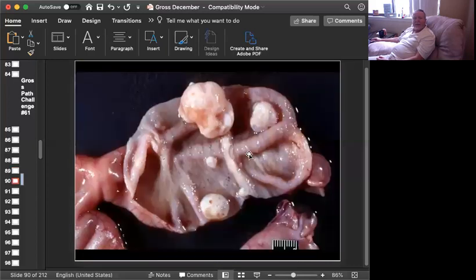Fantastic picture. Slide number 6 is tissue from a dog. Can you give me a morphologic diagnosis? Okay, time's up. This is a somewhat unusual one, but it does illustrate a couple of points. Okay, Williams' rule of bubbles, number one. When you see bubbles, and I see bubbles here, and here, and here, whenever I see bubbles, even these little highlights suggest there's bubbles.